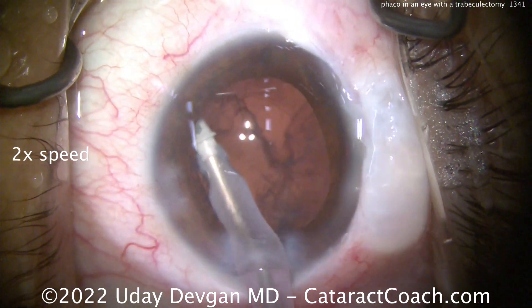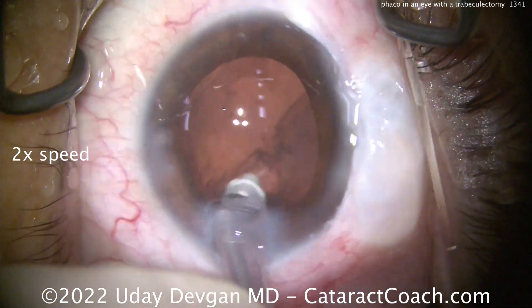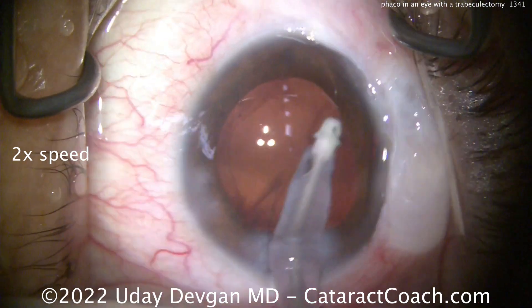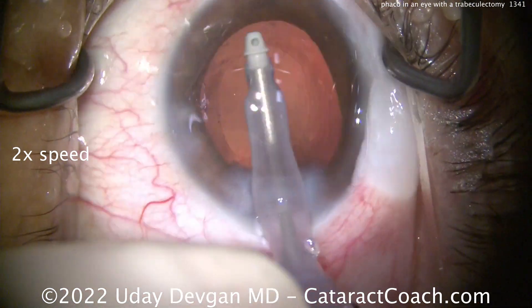Now clean up the cortex. In a case like this, you could put a suture in your incision — a 10-0 nylon in that corneal incision if you wanted to. At the end of this case I'm confident enough that it's not needed. But remember, this eye can get more hypotony compared to a typical eye in the post-op period.